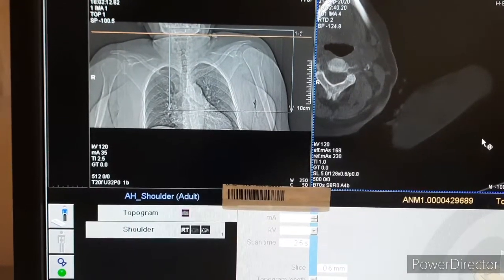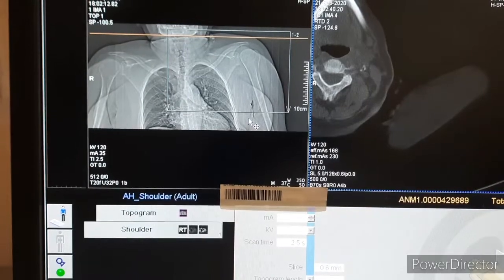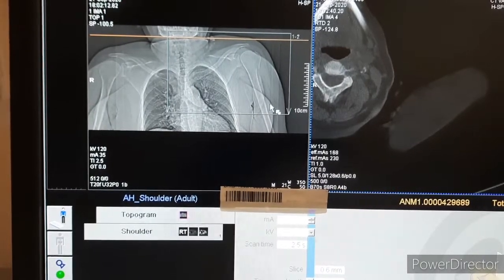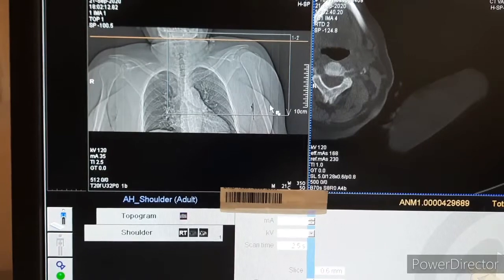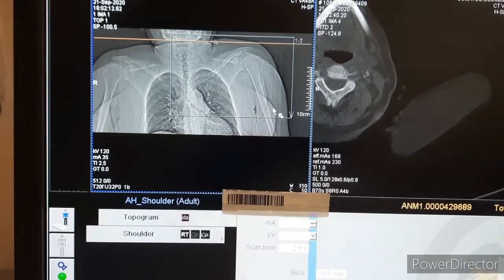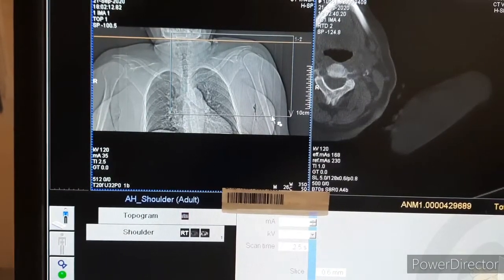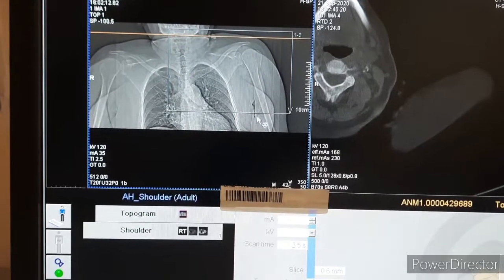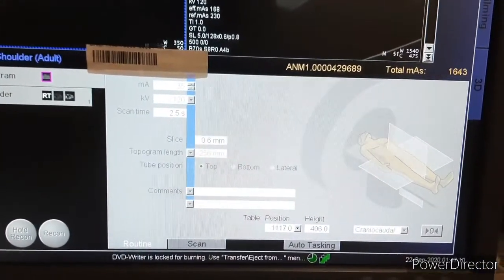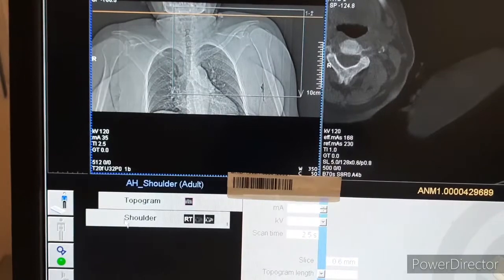Hello friends, welcome back. Today's topic is CT scan 3D shoulder. This patient has a history of fall. For preparation, we have to take written consent from the patient. Remove any metal around the shoulder area. Contraindication: make sure the patient is not pregnant. For positioning, we have kept the patient supine, head first.